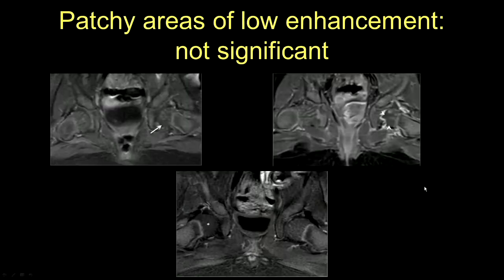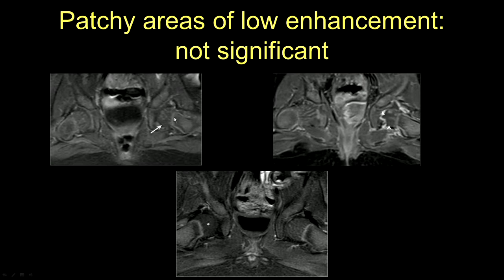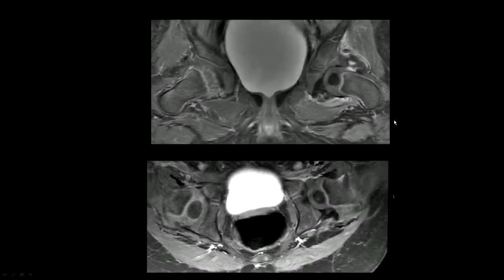So this is the value of subtraction. Another case showing no vascular canals because of ischemia. One important thing: if you have global ischemia like this, it is very significant. If you have just patchy areas of decreased enhancement, this has proven to be non-significant with time. Another case of global dysplasia showing global absence of perfusion.